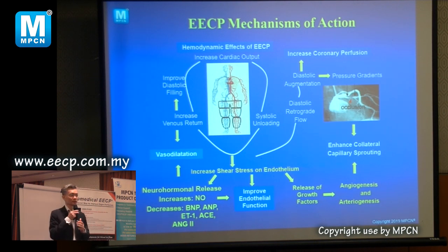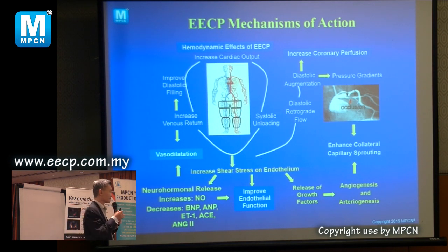When you do EECP, if you have done it, it's a very massive squeeze to the legs and the arteries. So this squeeze is actually a lot of stress, and this stress will release some of these chemicals. Some of the TCM people do this thing called paita. You know what is paita? Paita, you heard of it? Never heard of it? Okay. Paita means that they slap you.